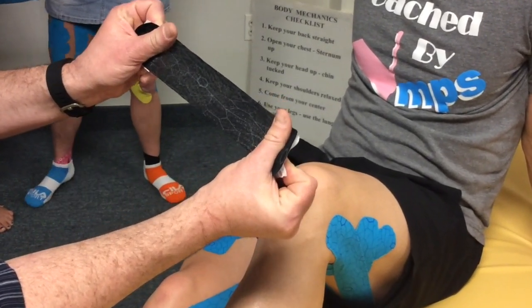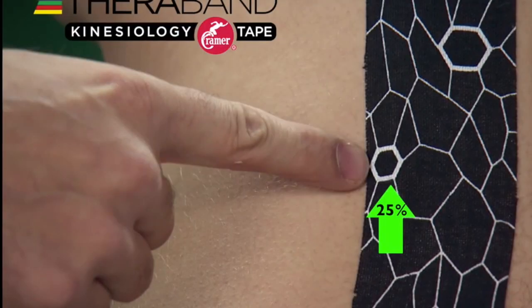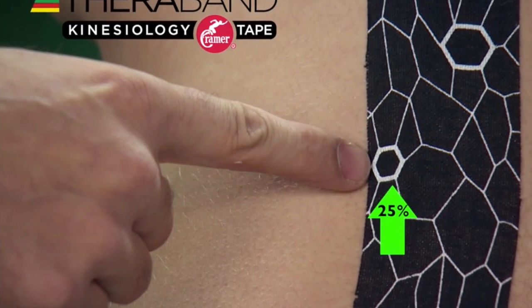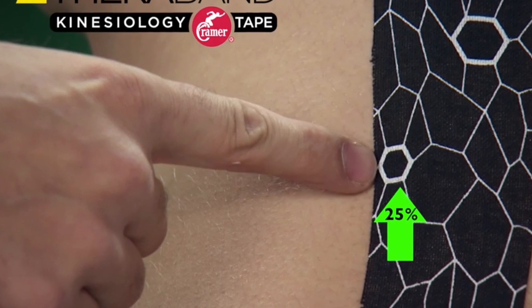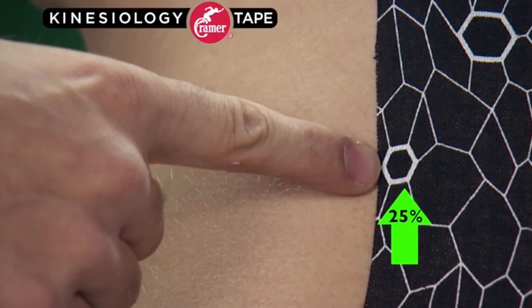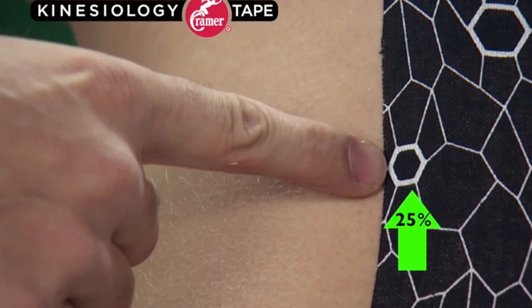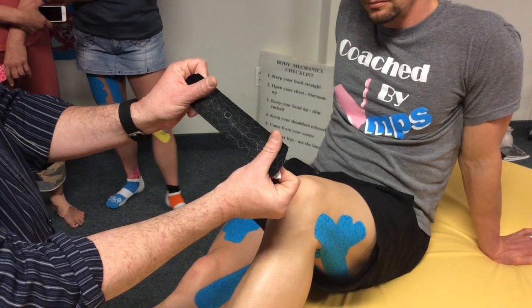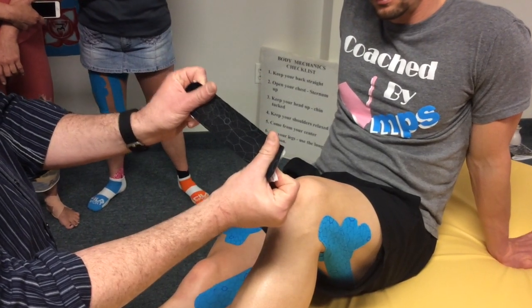Tear your first I-strip in the middle and apply equal tension across the middle third of the tape. We're looking to apply approximately 25 percent stretch for the first I-strip. By stretching the small hexagons of the exact stretch indicators to a symmetrical shape you know that you're at 25 percent. Or if you're using a different brand, you can easily eyeball it by stretching the tape to 100 percent, backing down to 50 and then to 25 percent.